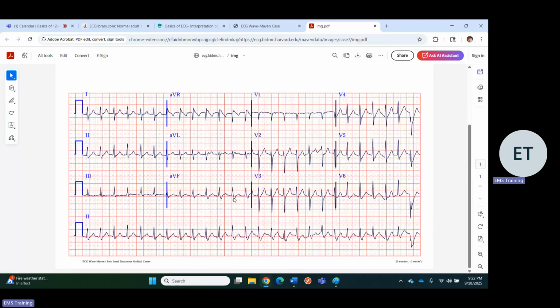Yeah, this right here looks scooped and wide compared to this. So something's happening here and the rate is different. Maybe not the rate, but the rhythm's certainly different. This has gotten taller consistently. I mean, honestly, the gain is a little bit small, so it's kind of hard to really appreciate it, but this is noticeably bigger than this, taller. And this is deep. And since the RS wave changed in its morphology from here to here, and then there's this notching at the end of it, which to me probably indicates an AVNRT, like post-septal activation atrial activity.